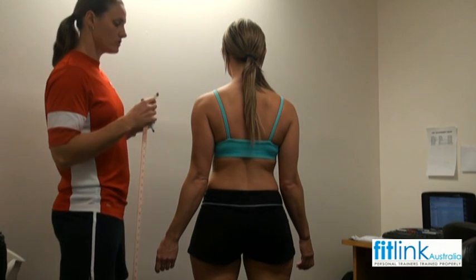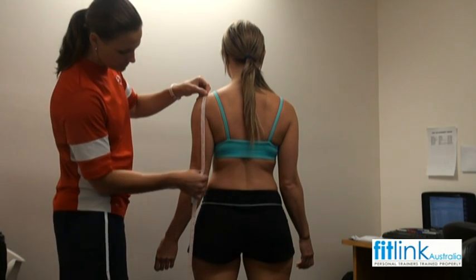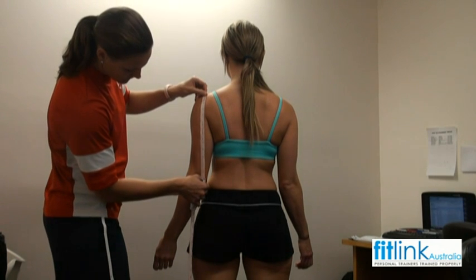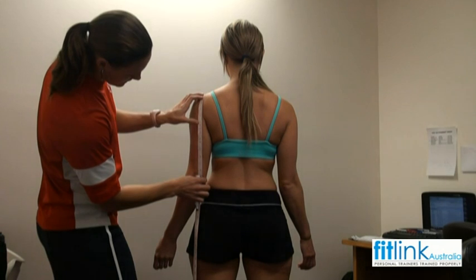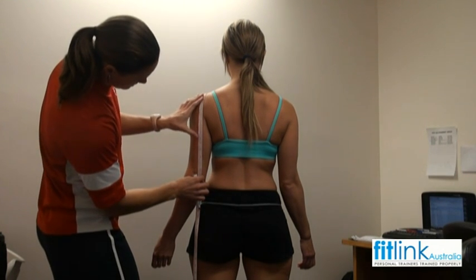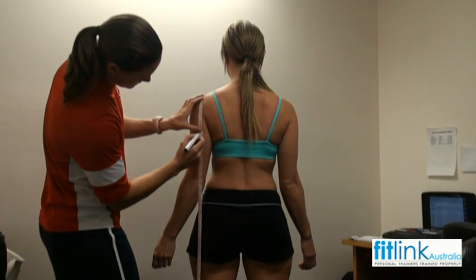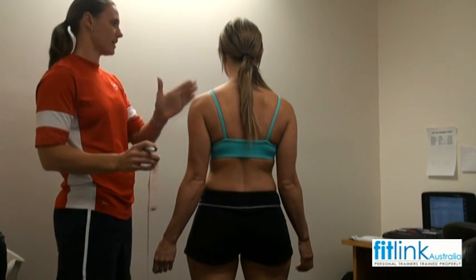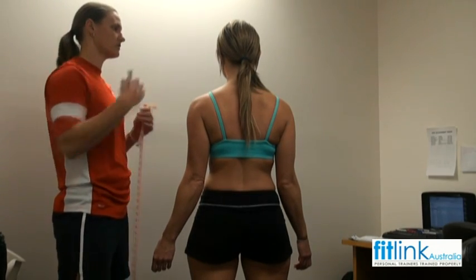Now I'm just going to take a measurement of your tricep. Starting from the top of your shoulder, running down the back of your arm, and then going back up halfway and placing your mark halfway. I'm placing marks on all the same sides of your body so I'm not having to chop and change sides.